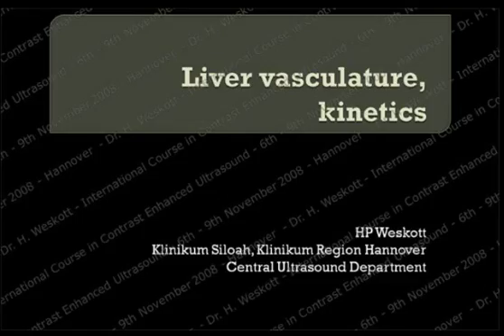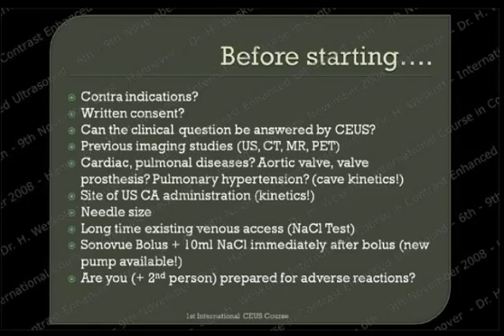So before starting, and we already discussed that: contraindications, written consent, and of course, can the clinical question be answered by using CEUS? Previous imaging study is always important. We don't look at them first, but we look at them when patients bring them with them.